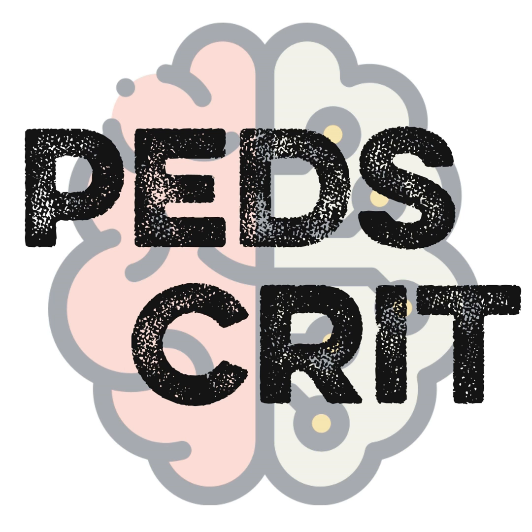And so that's a key point for all the cases in NAVA that we should emphasize: you have to look at the trends, not only at the screens, but go back to the trends over the last hour to 6 hours, etc., to see what the patient is doing, because it's variable. So it's very important. And so you also see the improvement or deterioration of the patient, but also what the current ventilation is. Paying attention to the tidal volume is important because it's not set. So it's very essential to make sure it's in the window that you consider safe.